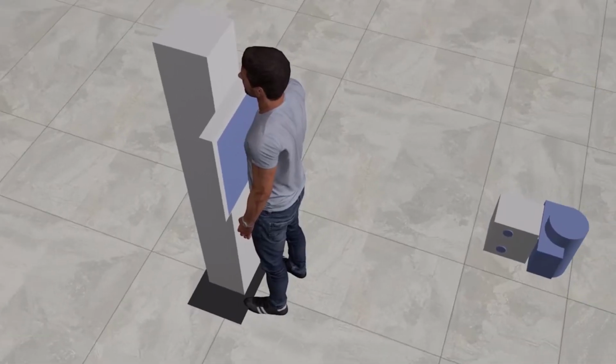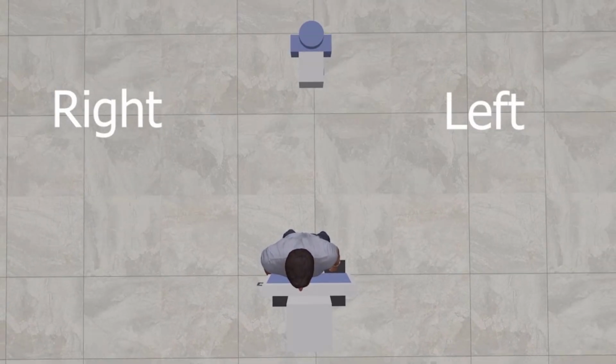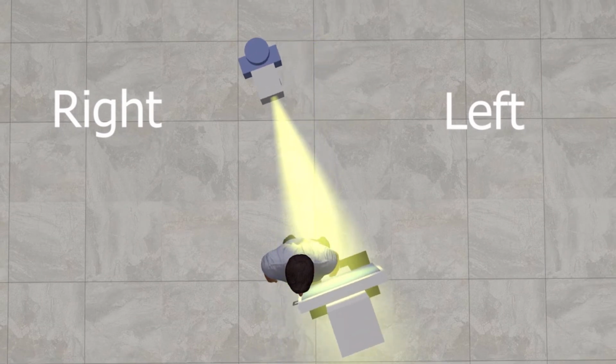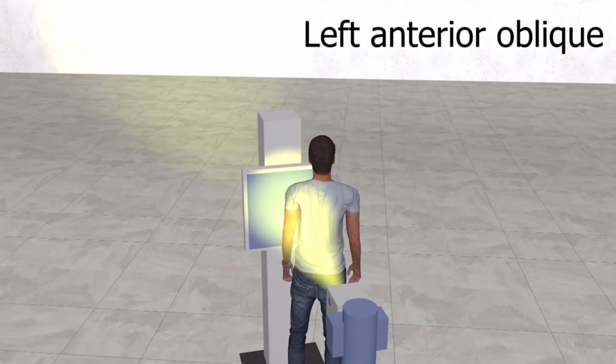Third case, the patient is standing, this is the right side and this is the left side, the front side is in contact with the cassette. If we tilt to the right, the left anterior side becomes closest to the cassette. Thus, we say that the projection is left anterior oblique.